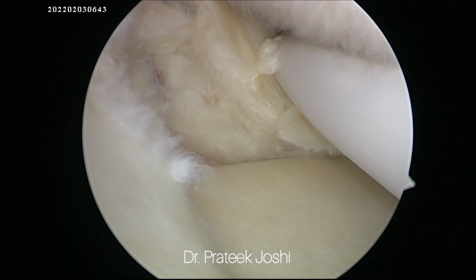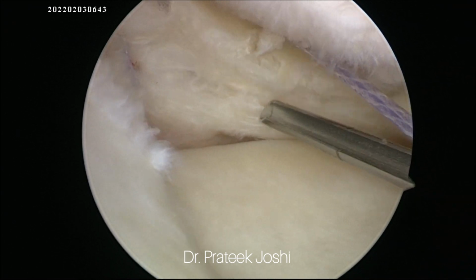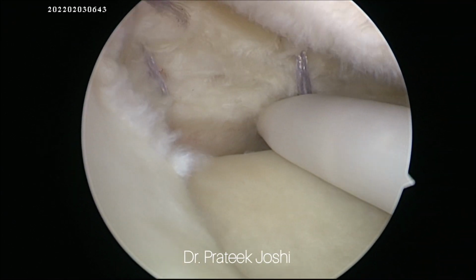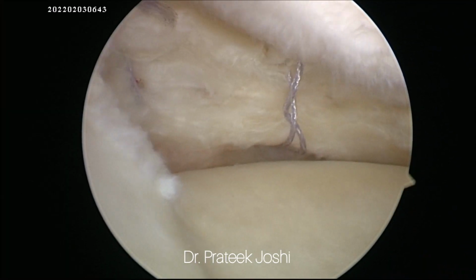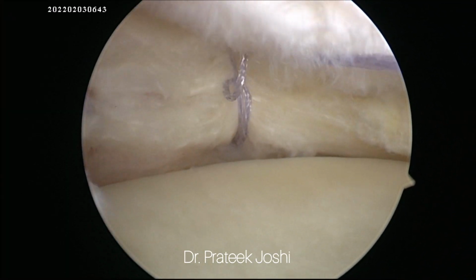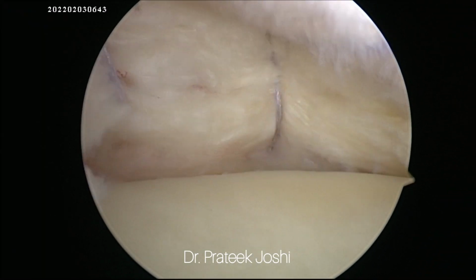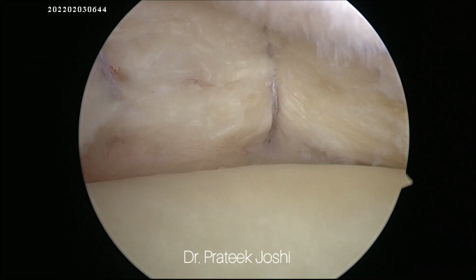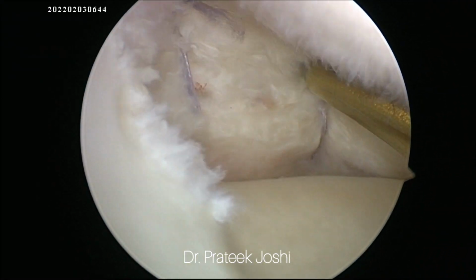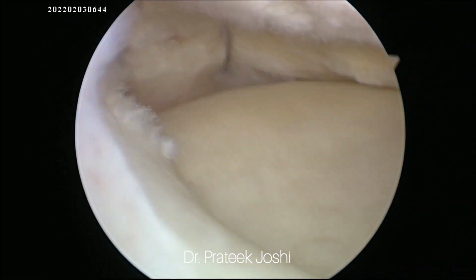I have deployed my first device, and now I am going inferior to the meniscus, and this is going to be my second implant. The second implant has been deployed, and now I'm going to pull the thread to tighten the knot, and once I do that, the knot is tightened, and then I'm going to cut my thread. So this completes the second stitch.